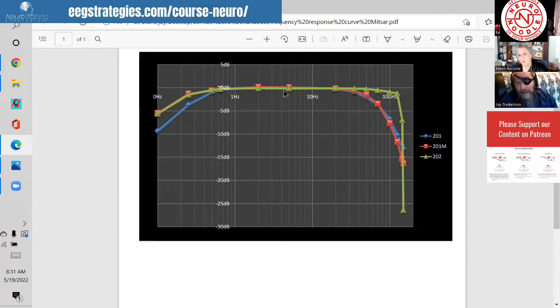Databases that were collected on modern amplifiers don't have to warp something down to them. They basically have a nice linear response. And most modern amplifiers are transposable. Different sampling rates obviously have to be corrected for, and the subtle differences at the low frequency and high frequency end generally have to be looked at. But the modern amps are awfully stable by comparison.